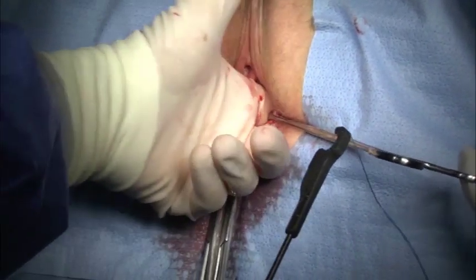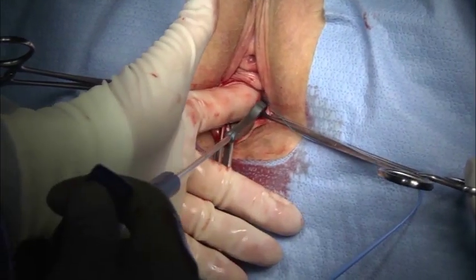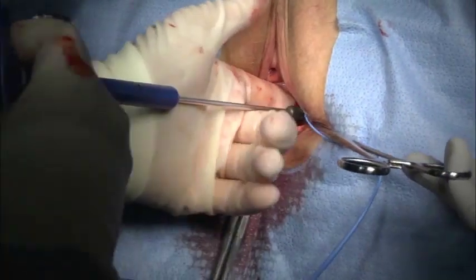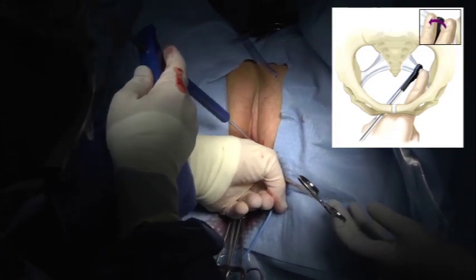I then position the capio device on the sacrospinous ligament between my index finger and the ischial spine. Just before firing the CapioSlim device, I reposition my left index finger on top of the capio device head to prevent any accidental shifting of its position during deployment of the capio dart.